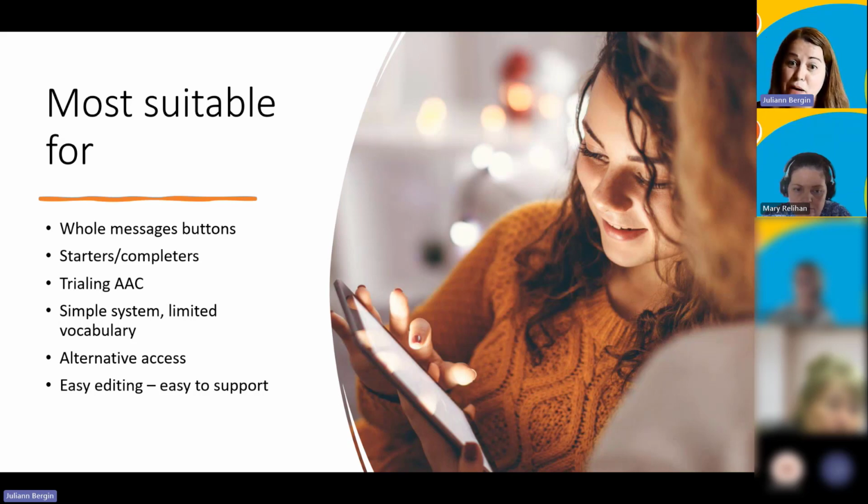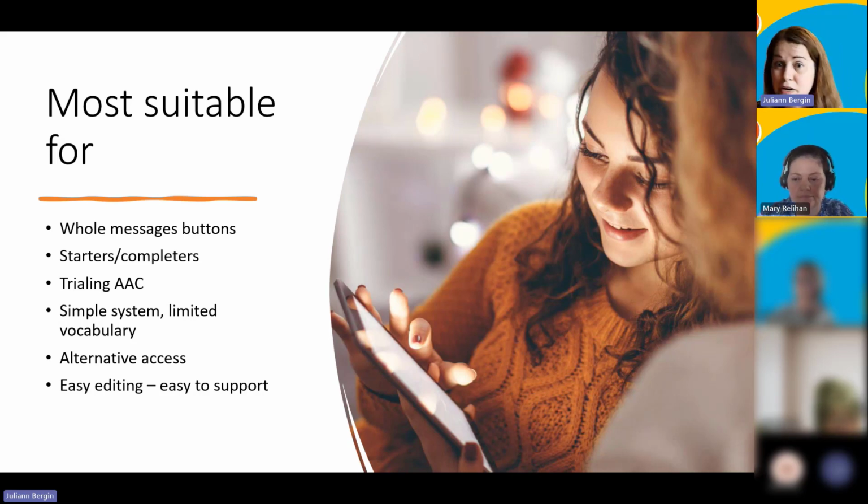It's got a limited amount of vocabulary that can be inputted, and we also talked about the alternative access. One of the reasons I really like it is because it's so easy to edit. So it could be handed over to whoever's in that person's circle of support, be it an SNA, a PA, family care, teacher, whoever's supporting that person, and they can help support by inputting appropriate vocabulary in a timely manner so that the person can actually use it.